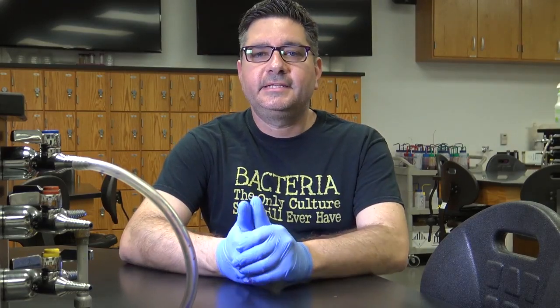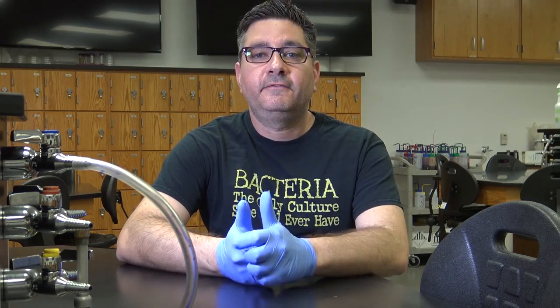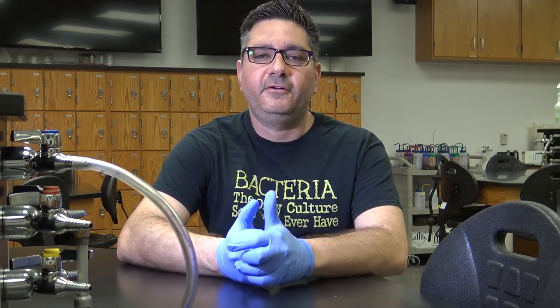Hello, today I would like to discuss with you the various types of media we will be working with today. First, I'd like to go over what it means to be sterile and what it means to be unsterile.